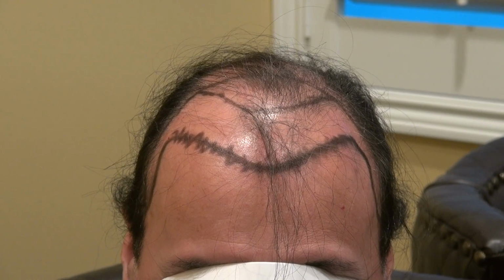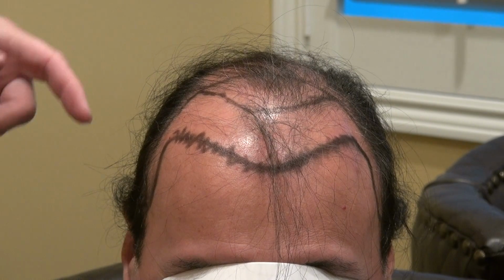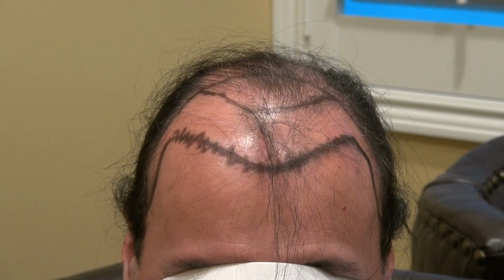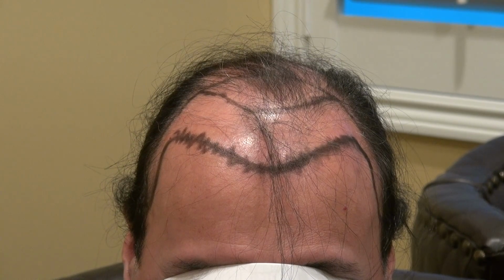Hi, this video is the art of hair transplant restoration surgery on a client with a class 4 or 5 hair loss pattern, and he's actually losing from the front all the way toward the back. So he has some residual hair on top, but it's thinning. It's on its way out. So our goal is to harvest at least 4,500 grafts using the strip method and fill from the front all the way toward the back.